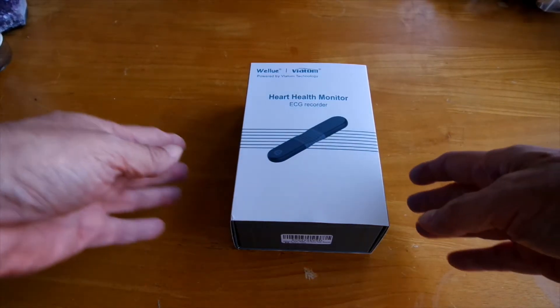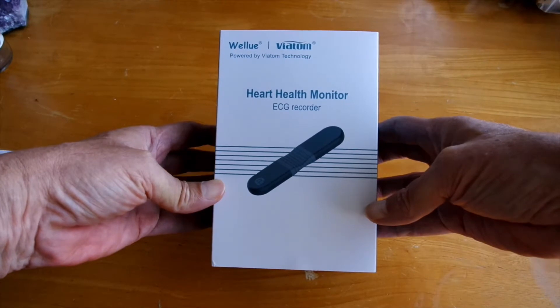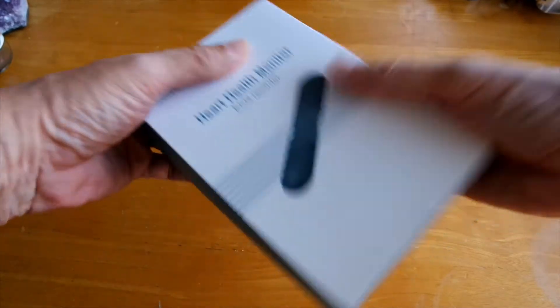Today we will be doing an unboxing and review of the WellView AI heart monitor. This is what it looks like, and let's take a look at what we get on the inside.